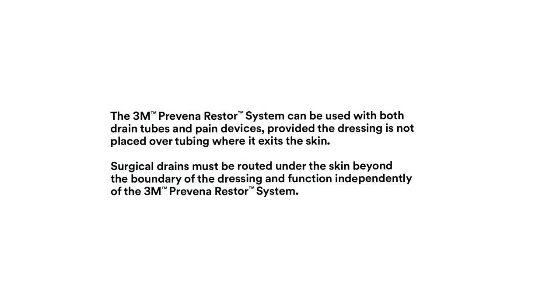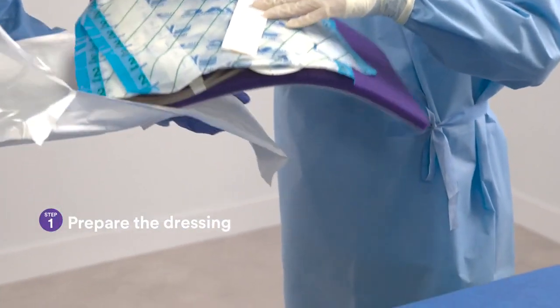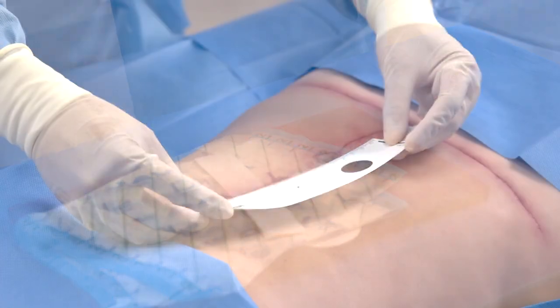Surgical drains must be routed under the skin beyond the boundary of the Prevena Restor dressing. Open the sterile dressing package and remove the foam dressing using aseptic technique. Do not use if the package has been torn or the sterile seal has been compromised.